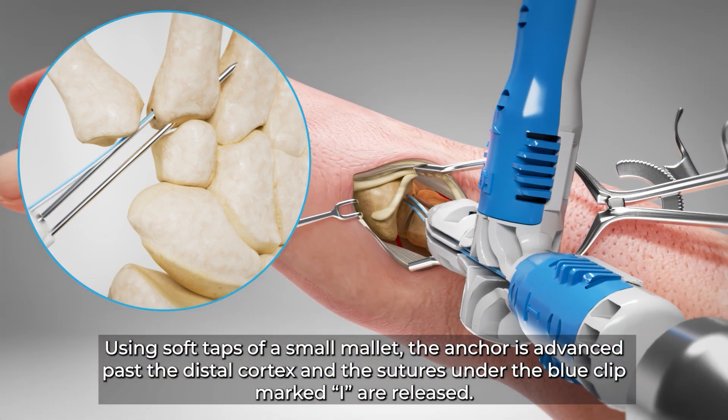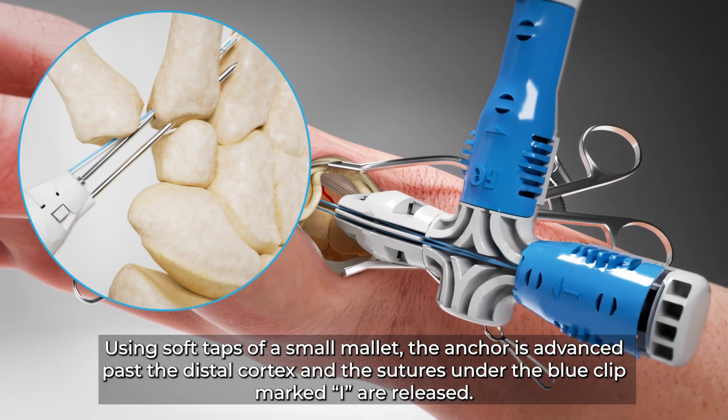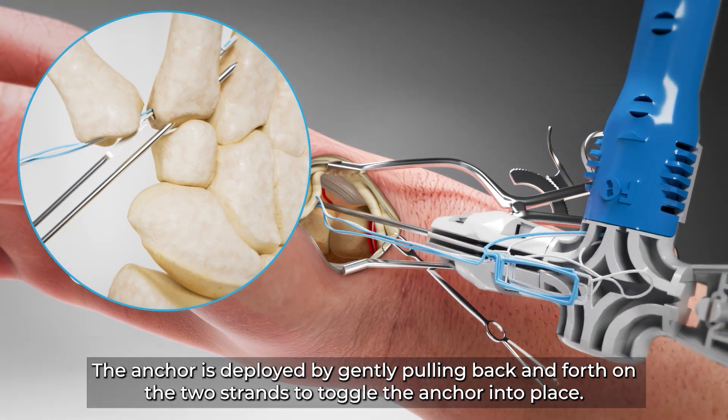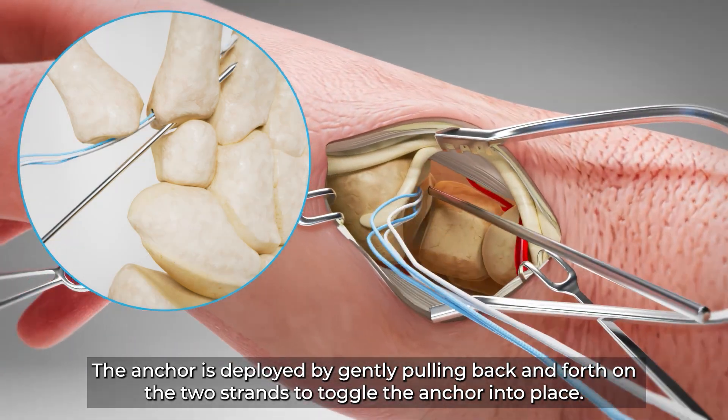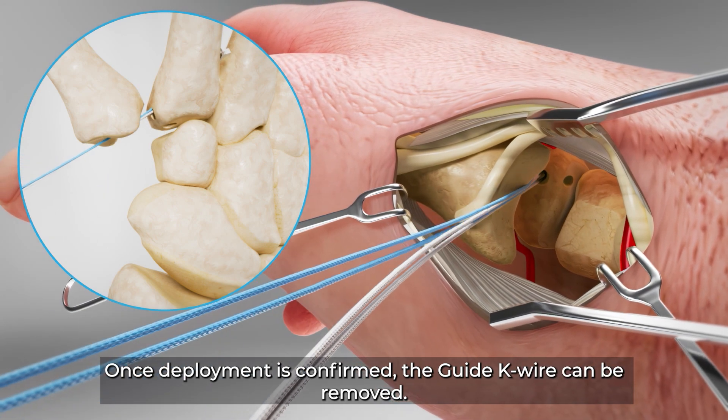Using soft taps of a small mallet, the anchor is advanced past the distal cortex and the sutures under the blue clipped marked I are released. The anchor is deployed by gently pulling back and forth on the two strands to toggle the anchor into place. Once deployment is confirmed, the guide K wire can be removed.